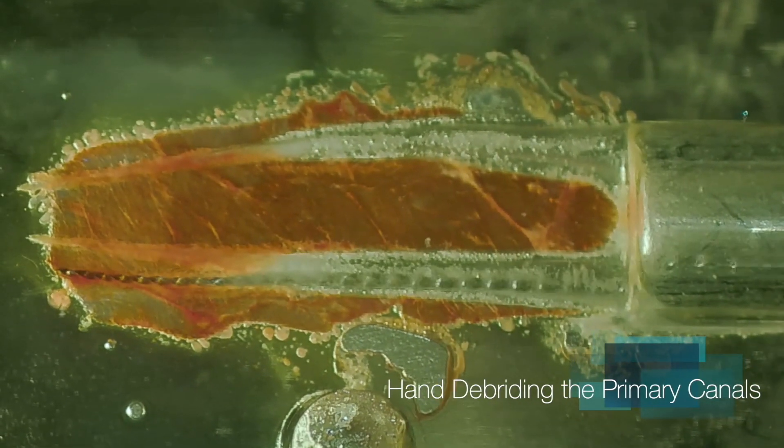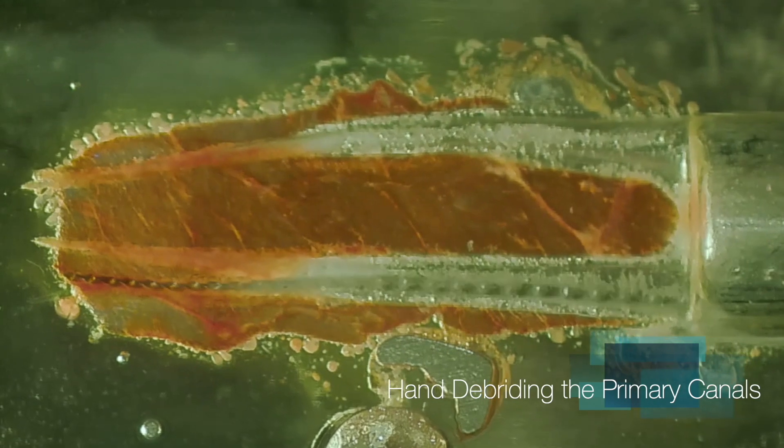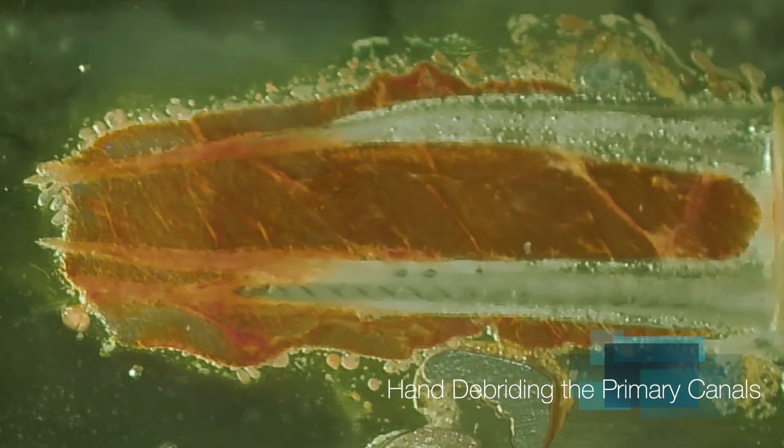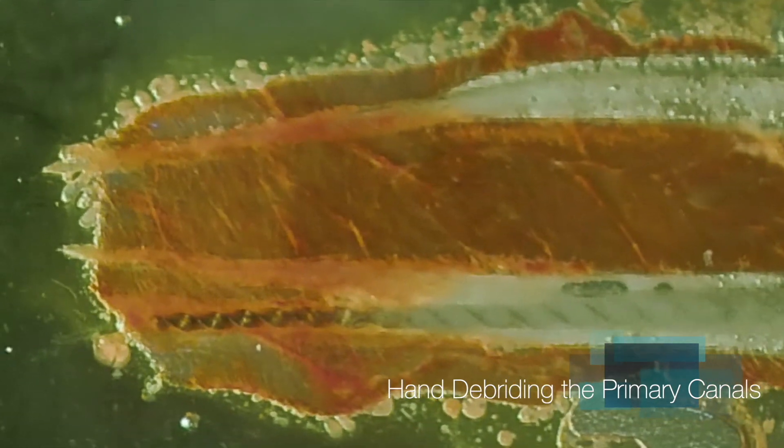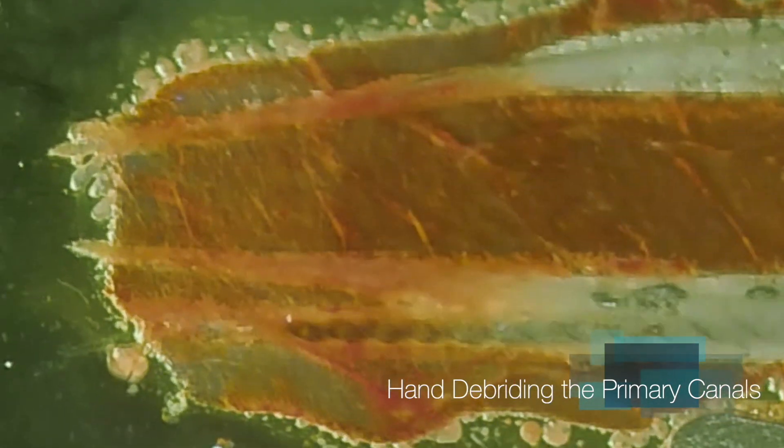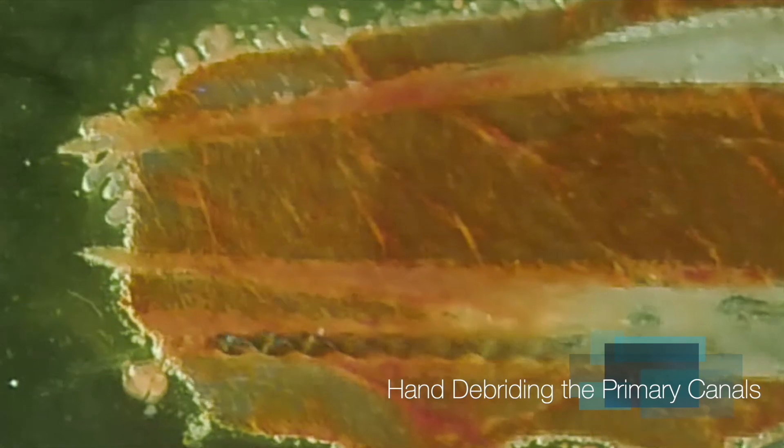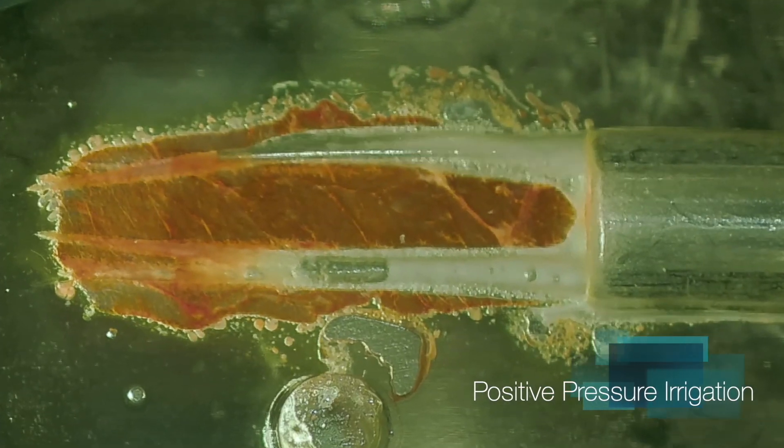The first thing I want to show you in this block is how useless hand instruments are for debriding canals. Basically, they just mush it up in there, but don't really take much of anything out.